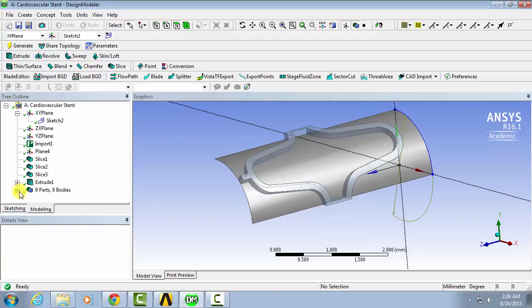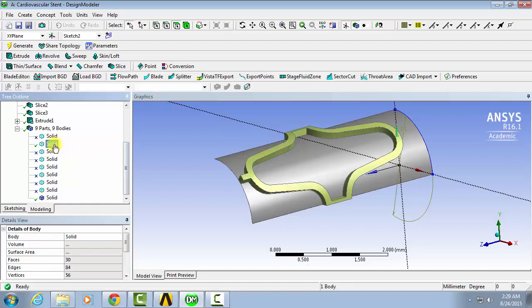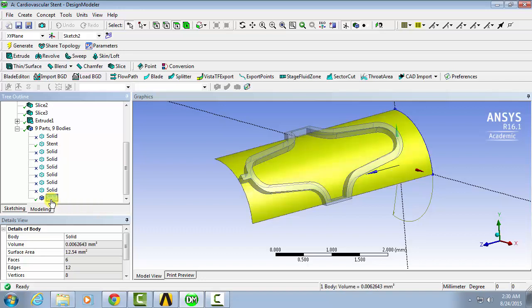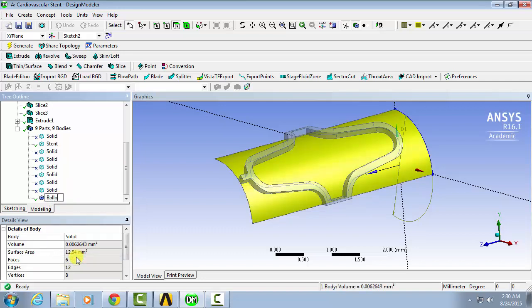Now we'll just name the two bodies that we have left over so that we can find them later on. So we'll right click, rename this first one to stent, and then we'll rename the balloon to balloon. And then just save project.